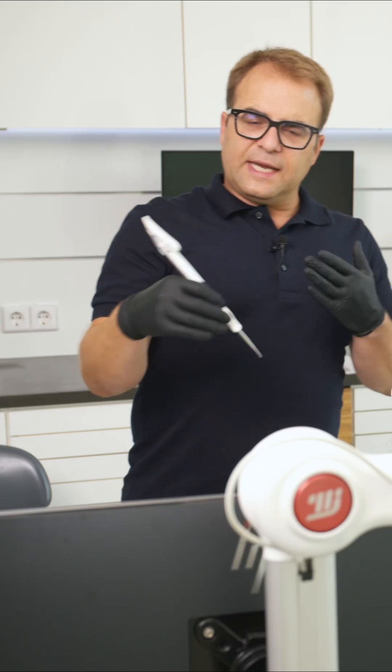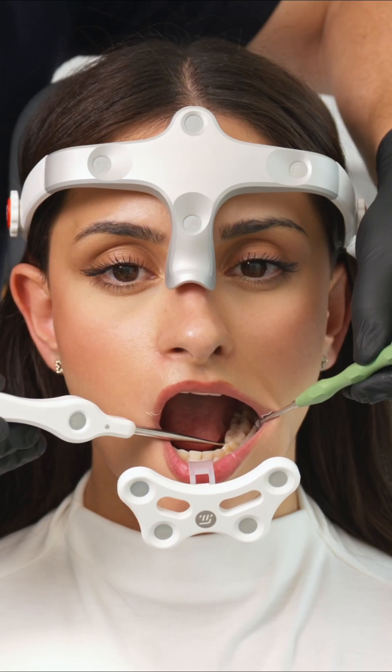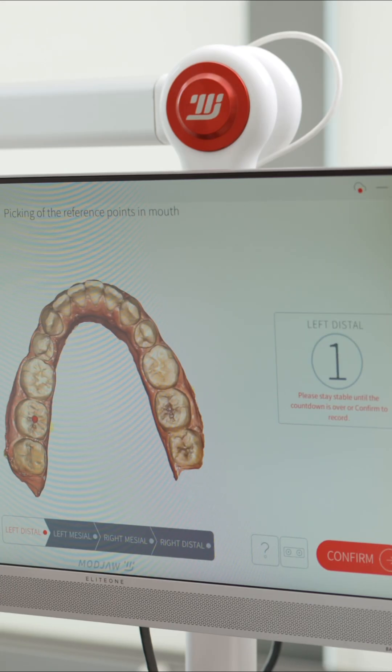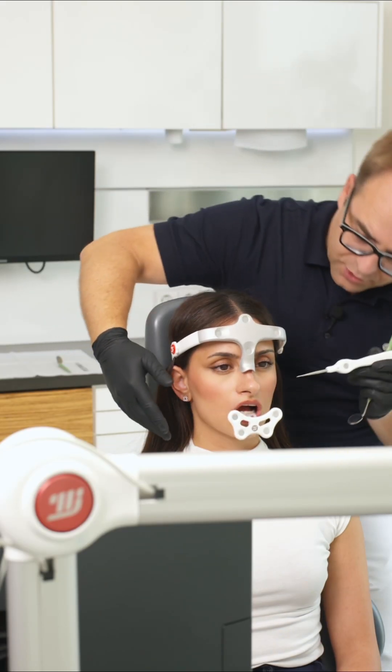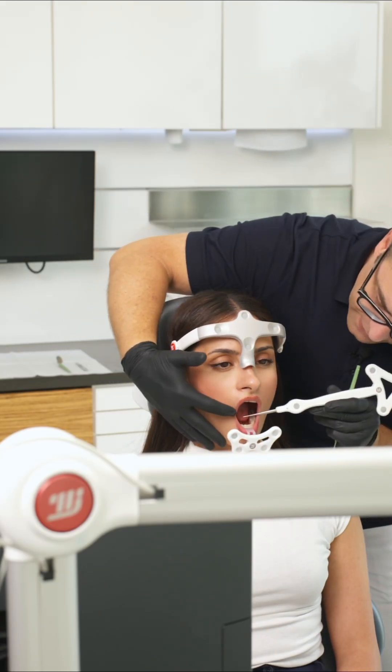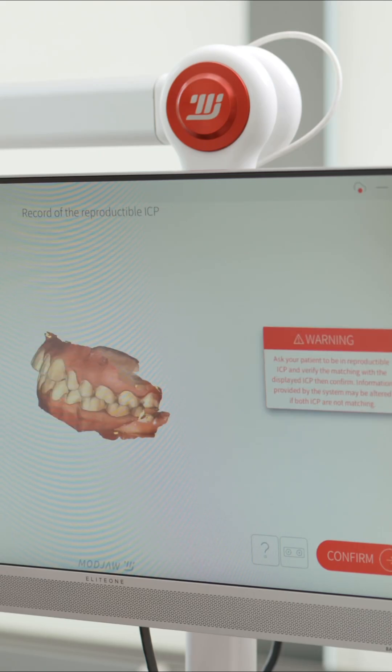The next step is to relocate the occlusal reference points. You have to be sure to find the correct spots, of course.